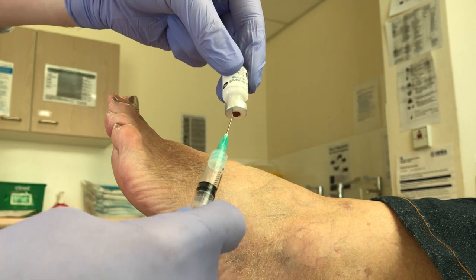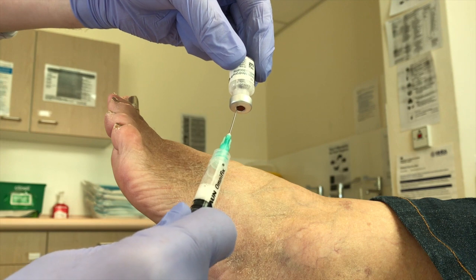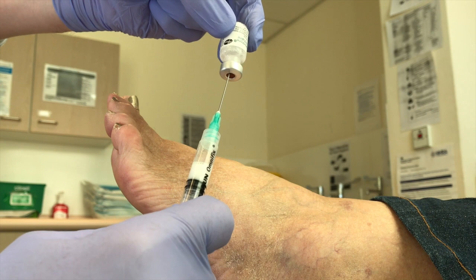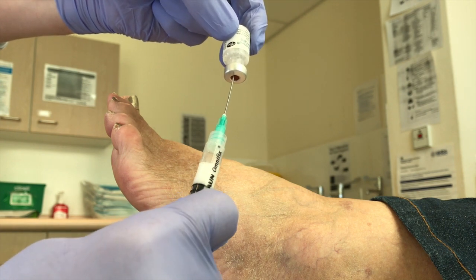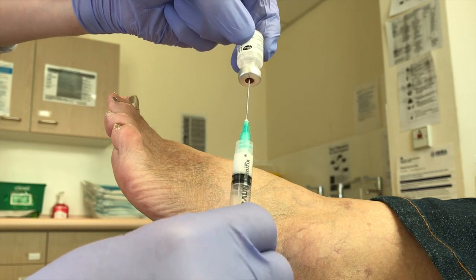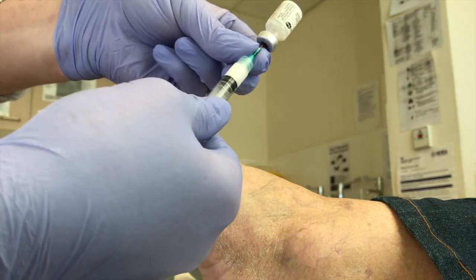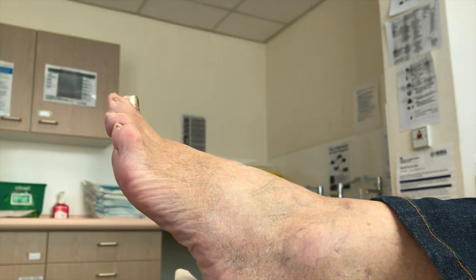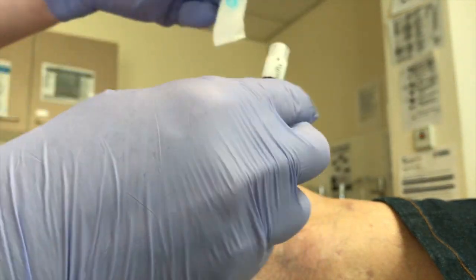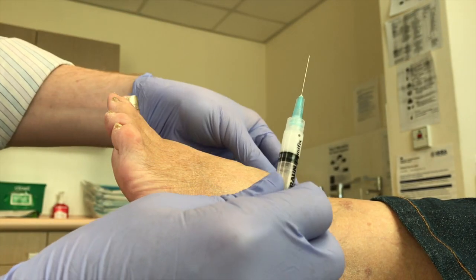Draw it up. Take all the air out. Green needle to draw it with is my preference, as you know — 21 gauge. Take all the juice out and make sure there's no air left. We'll get rid of our green needle and use a blue needle. You can go smaller, but blue's real nice for these. And that's our needle ready to go.